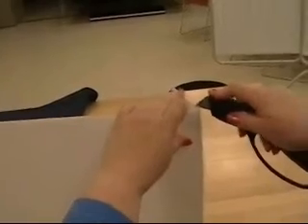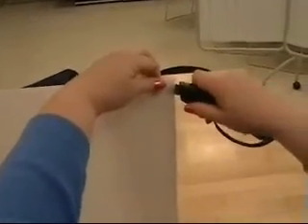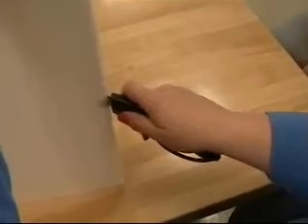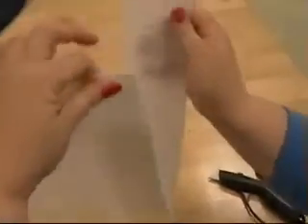We want to use the 1/16 of an inch material because it works better on the finger in terms of bulkiness and weight. And then I'm going to cut down that score line. We want the splint to be half the circumference of the finger, and we want it to cover from just distal to the MP crease to over the tip of the finger, although that could vary based on why we're making the splint.